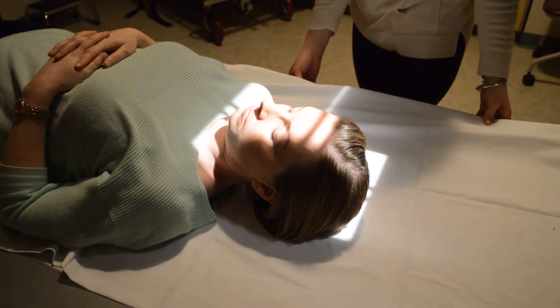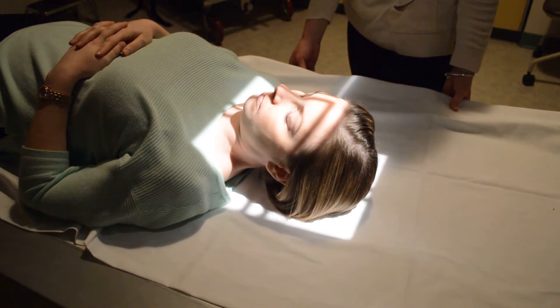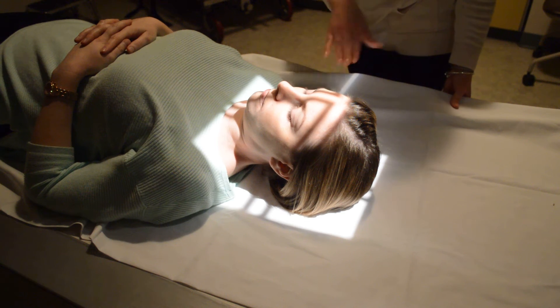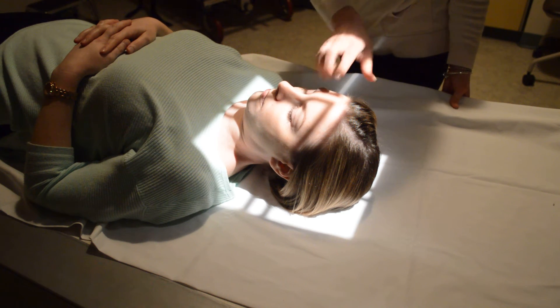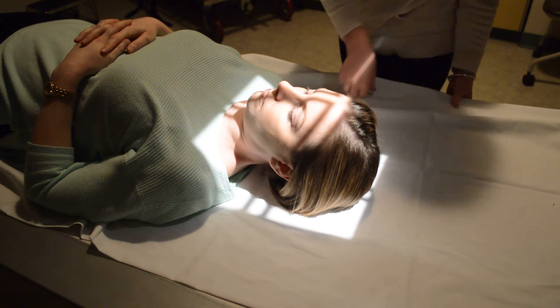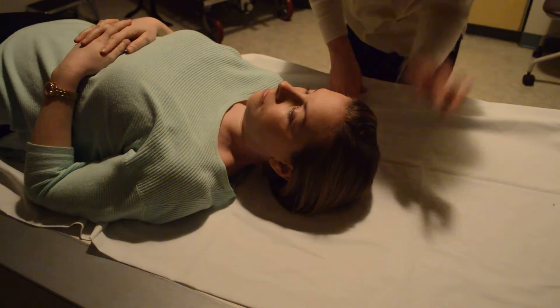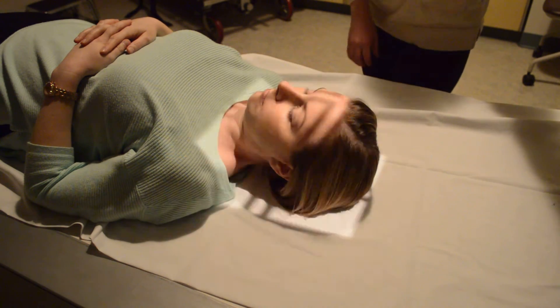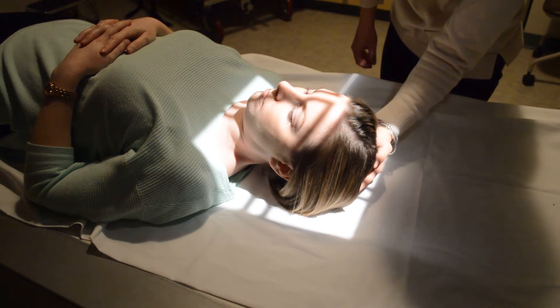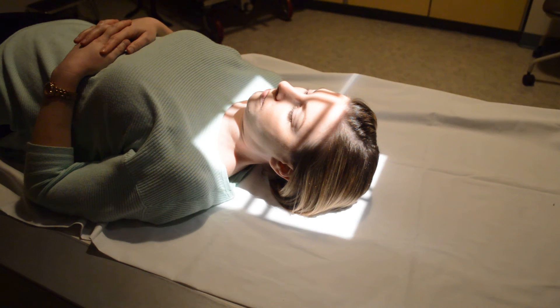I want to be mid-sagittal for this, and two and a half inches above glabella, which for most people is usually right about the hairline. Since this is the skull, make sure you are seeing light above the vertex. If not, compensate your central ray.